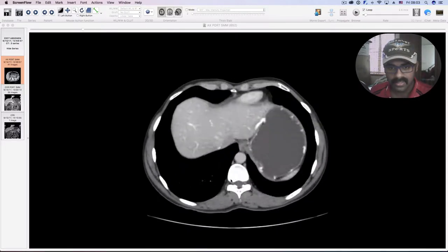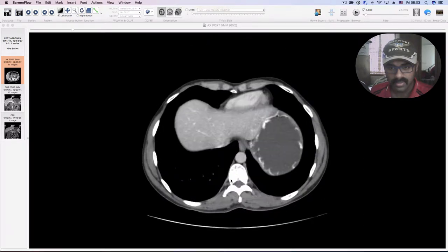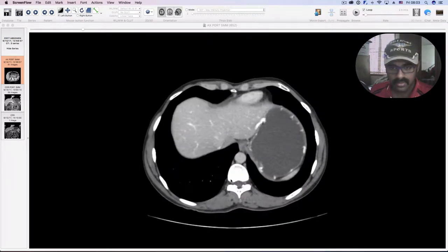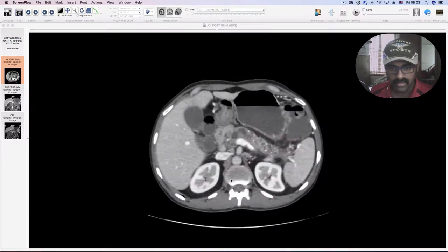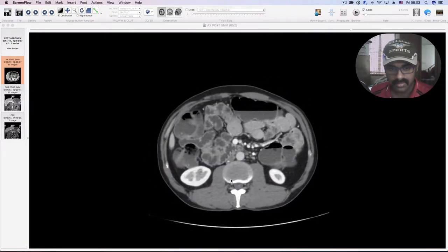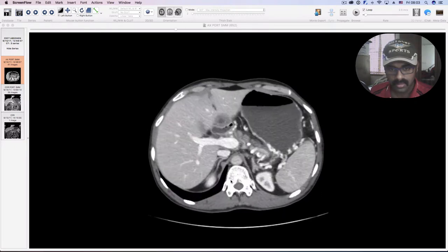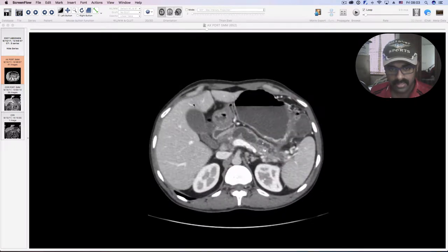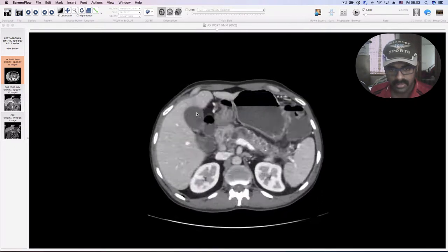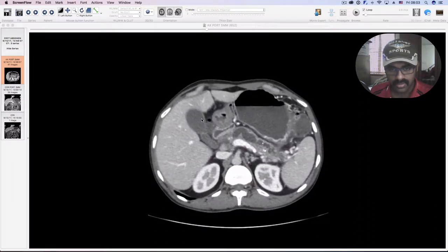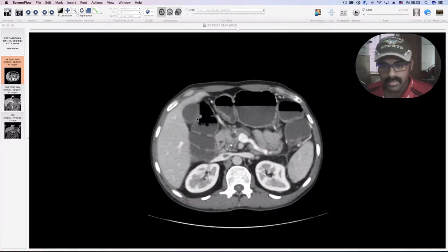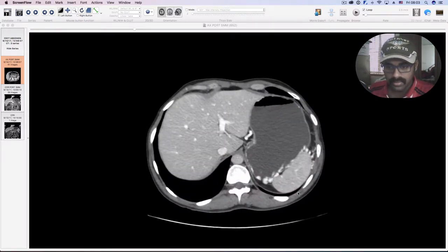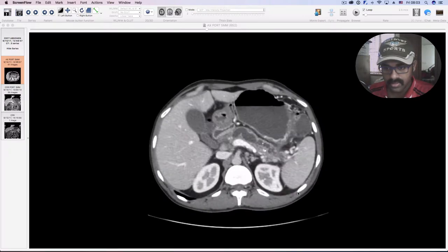First I've loaded the axial sections. As I come from the higher sections from the dome of the diaphragm, the liver is normal in size and parenchymal enhancement. The gallbladder is well distended and does not show any radiodense contents within, with homogeneous bile density within it. The spleen also appears to be normal in size.